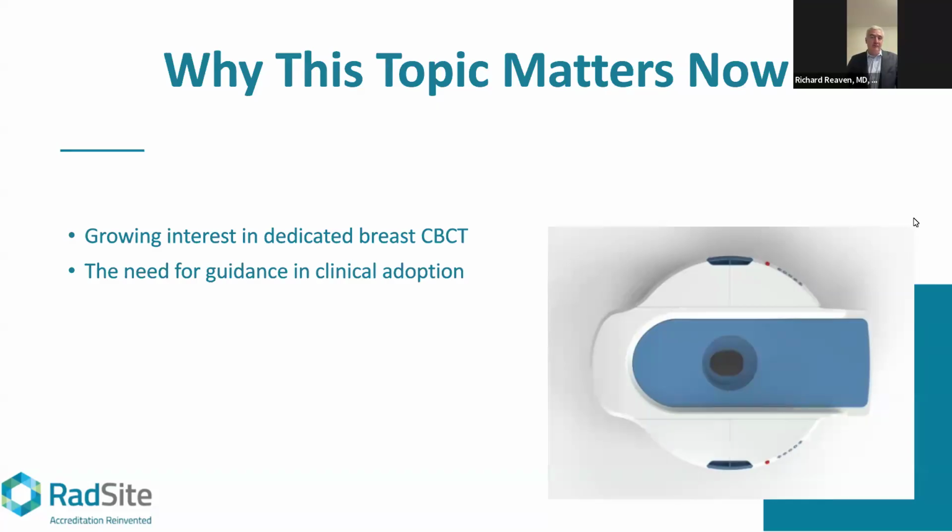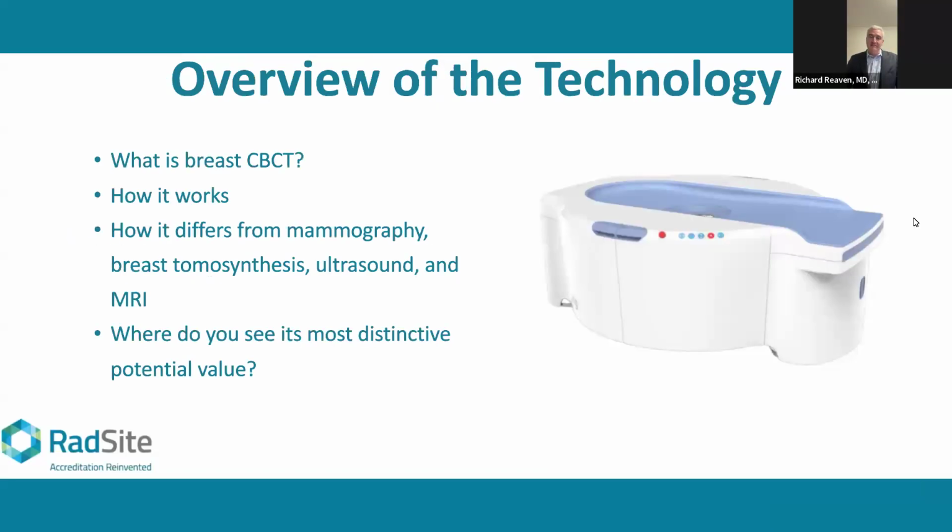Sure. So what the technology is, basically, it's using the same mammography tools, right? A mammogram is basically an X-ray of the breast. And so it uses a generator and it uses a detector. And the breast is in between, so it generates images of the breast.